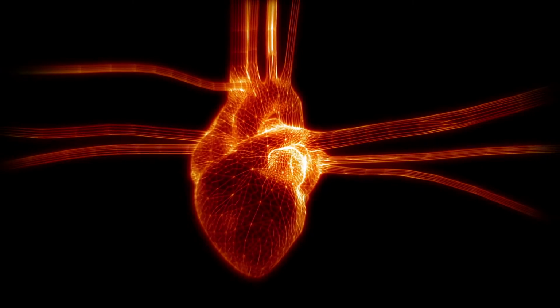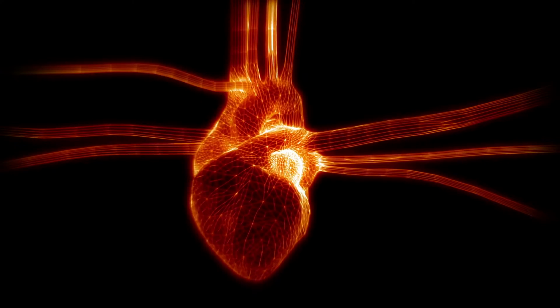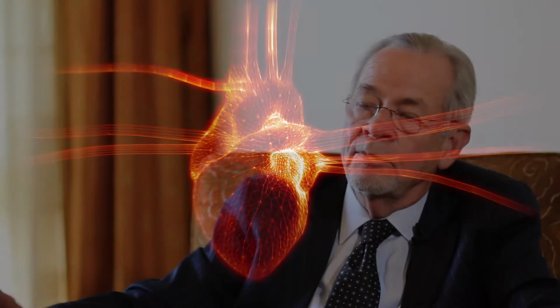Then the aorta goes back to its normal elastic shape, and that has a further effect of propagating this wave all the way down to your feet and to the furthest, most distal vascular beds. And you can't help but believe that that's got to give you a better perfusion than no pulsatility at all.